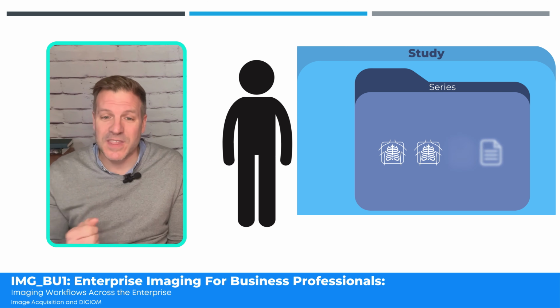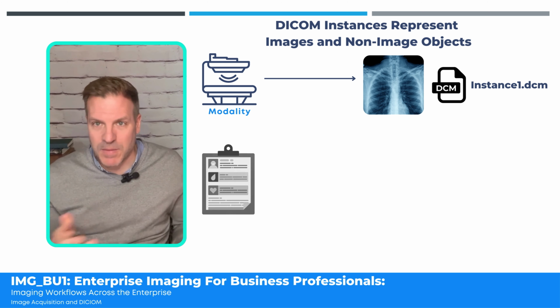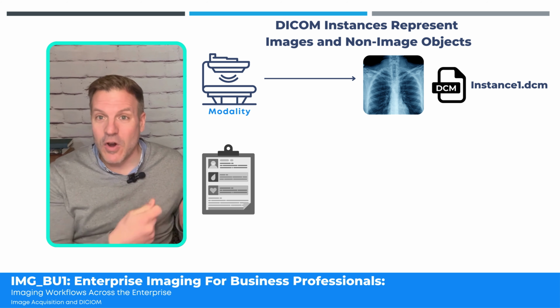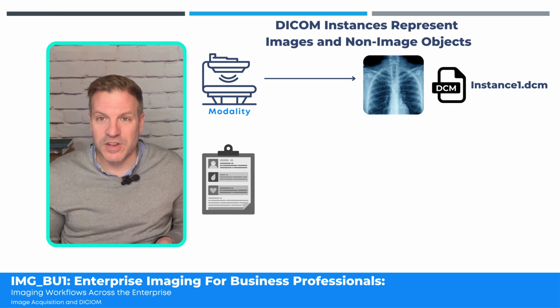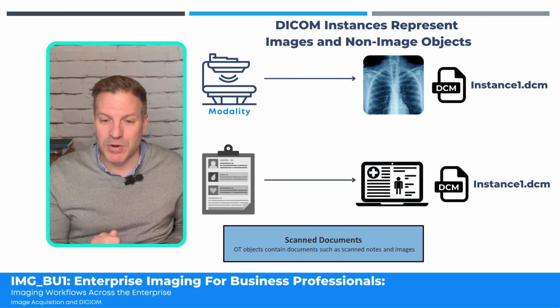So examples of this are where we have things like a scanned document. So the patient is scanned on the modality. There are some notes that have been captured, perhaps on paper, and that's going to be scanned in as a separate document.